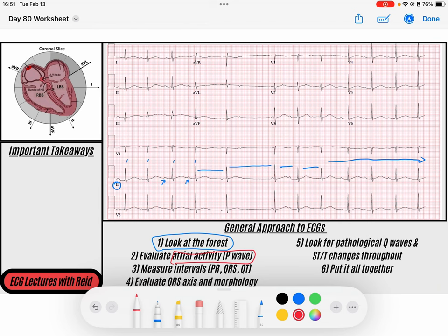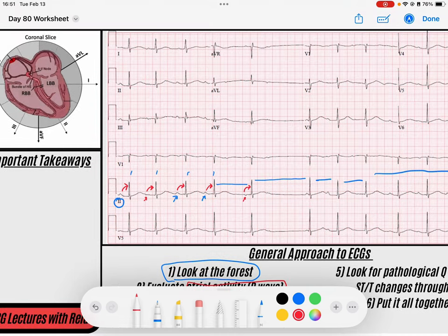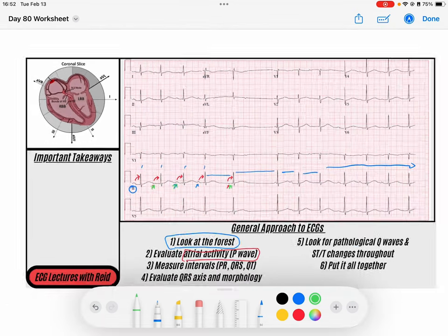I see P waves that we noted. I've got a P that goes to this QRS, a little P right here that goes to this QRS, and P's in front of our QRSs throughout. However, I do notice that some of these P waves don't have the same morphology. Especially this P wave has a different morphology from the others, and then we've got this negative P wave here — so a couple of P waves that may not be our sinus P waves.